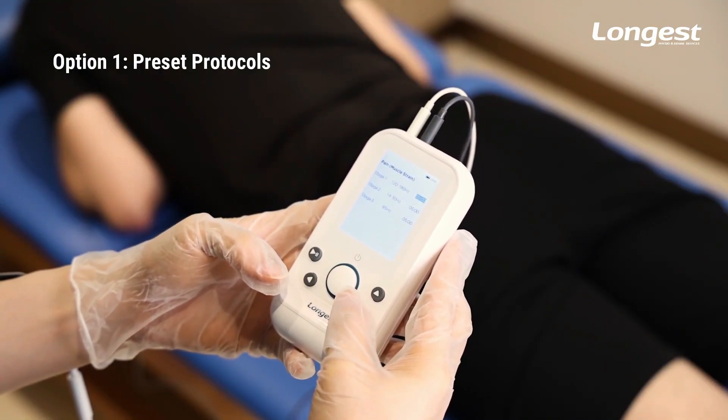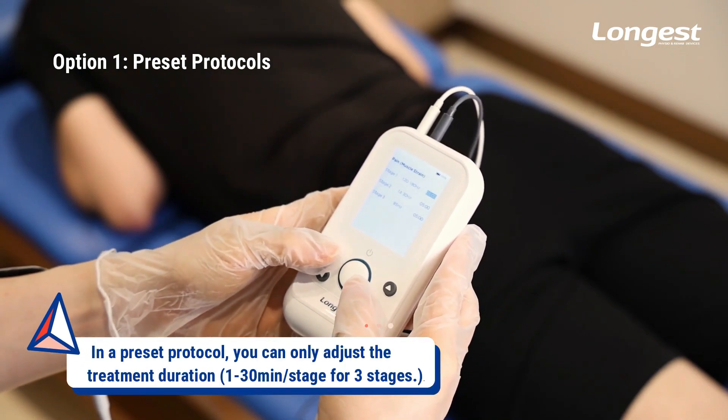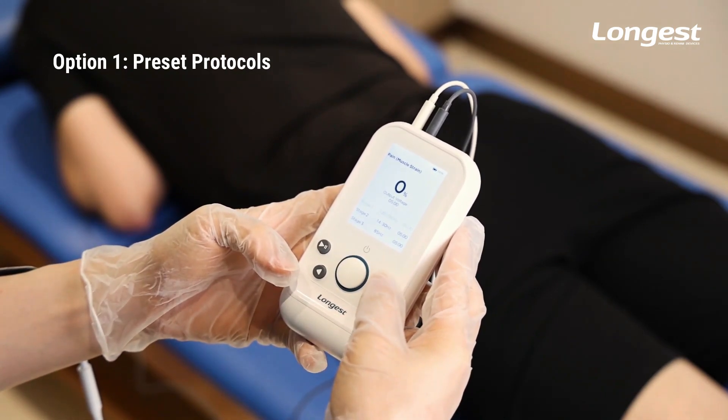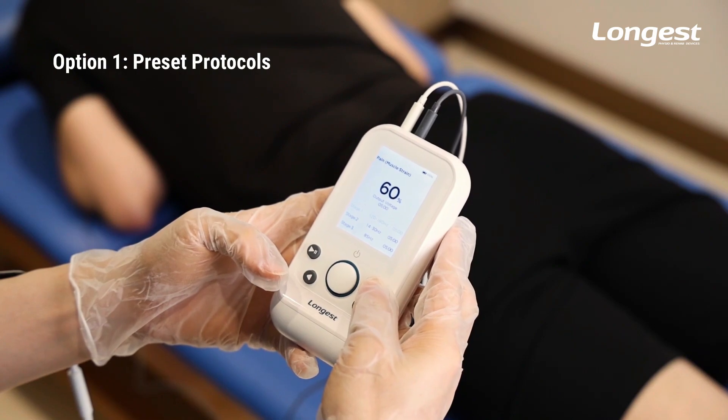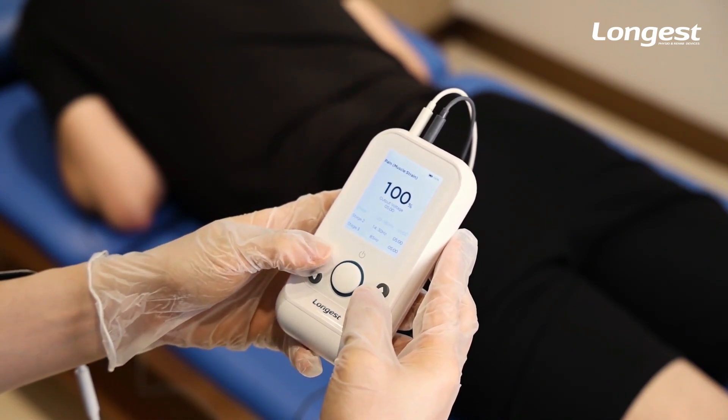You then enter the parameter setting interface, where you can only adjust the duration of treatment. Press the button to enter the treatment interface. You can adjust the output voltage by pressing the button, then press the button to start the treatment.